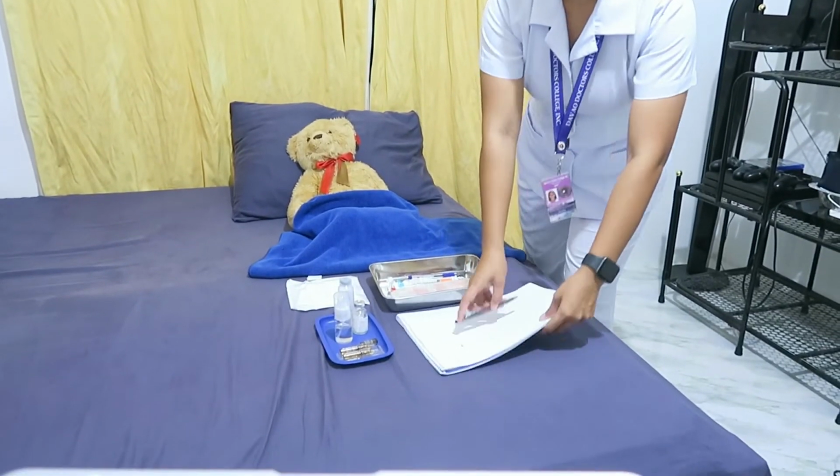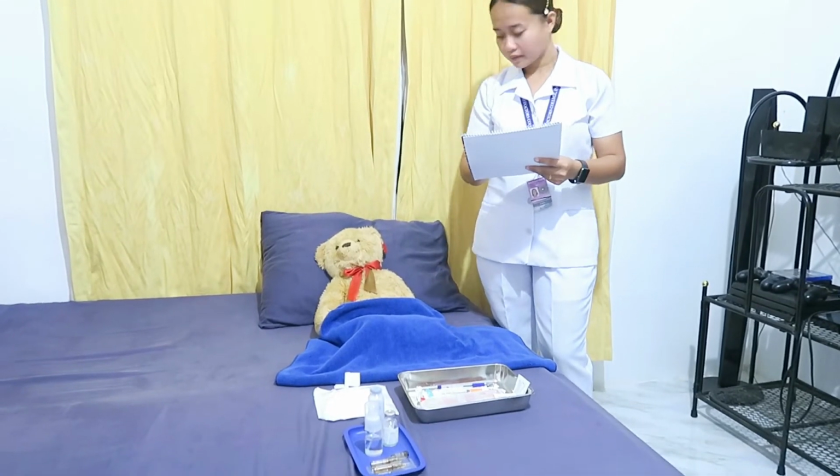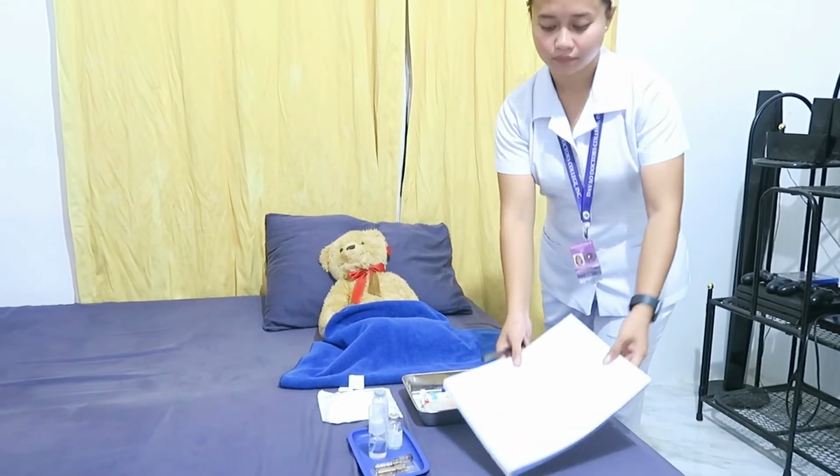So let's proceed to the parenteral drug administration, subcutaneous injection. First, the general preparation is to check the doctor's order. The rationale for this is to verify that the client's or the patient's medication is being ordered in the doctor's order sheet, or to check the MAR, or the medication administration record. Let's proceed to the subcutaneous injection.